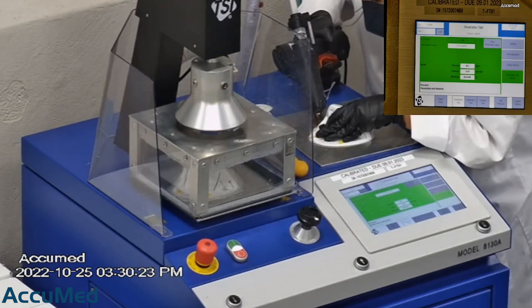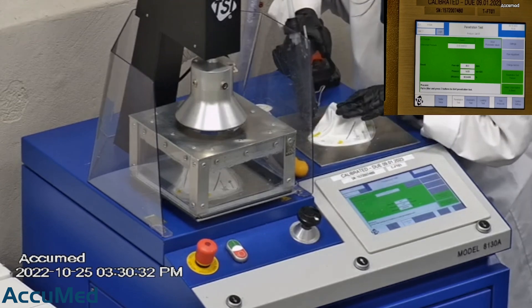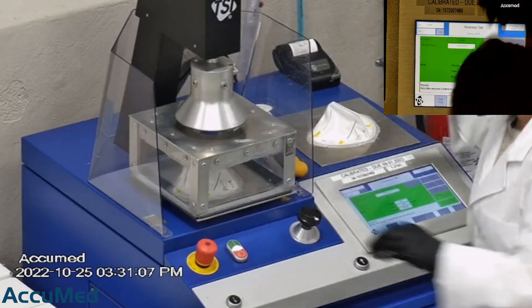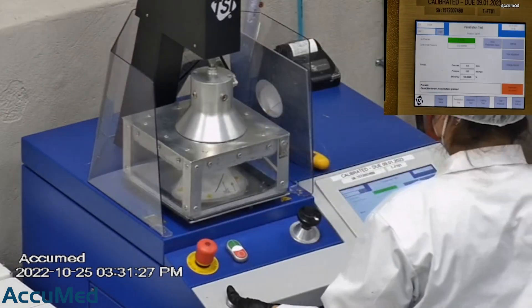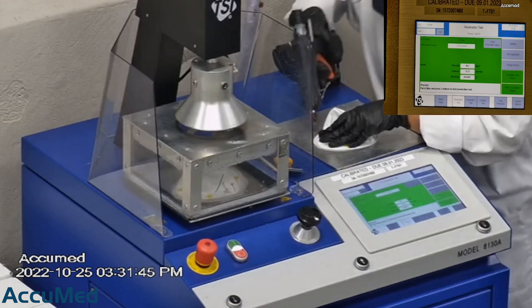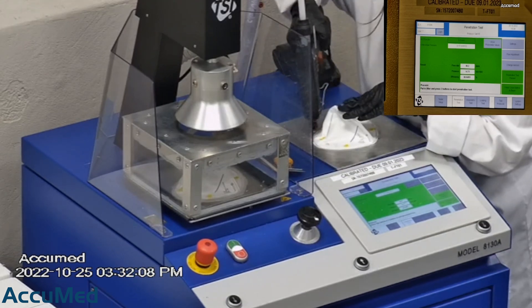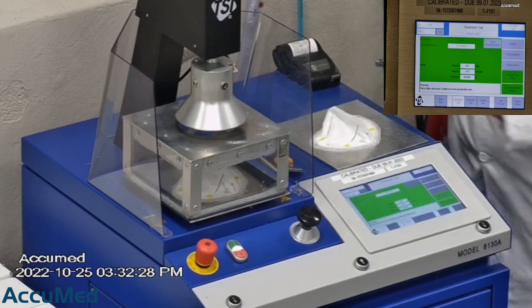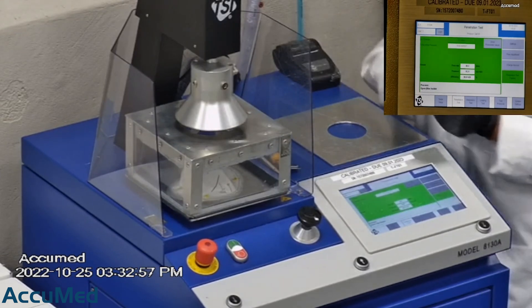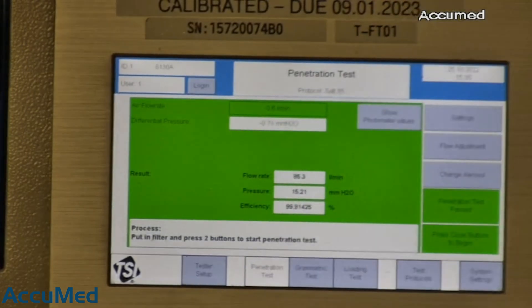The first sample tested at 99.94% with a pressure drop of 14.6 millimeters of water. The second sample tested at 99.64% and had a pressure drop of 14.7 millimeters of water. The last sample's filtration tested at 99.91% and had a pressure drop of 15.2 millimeters of water.